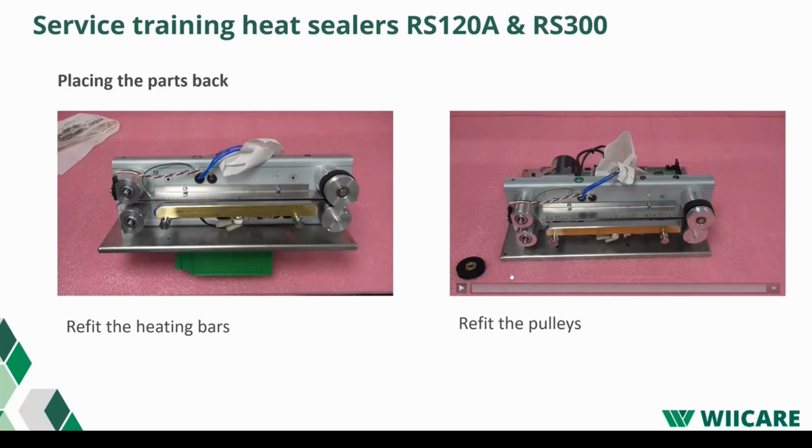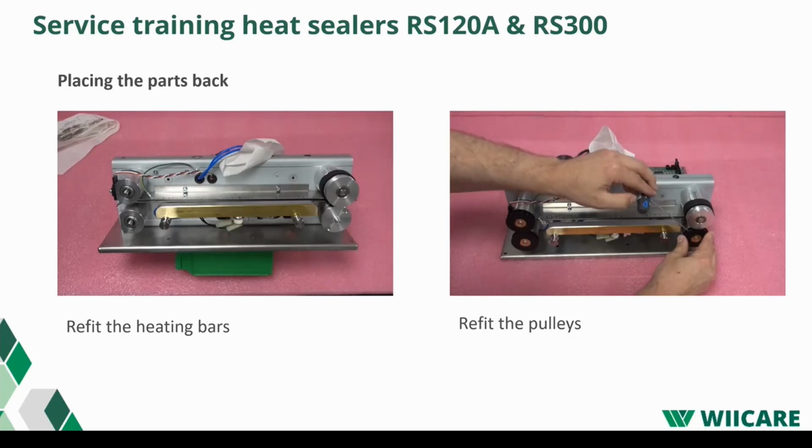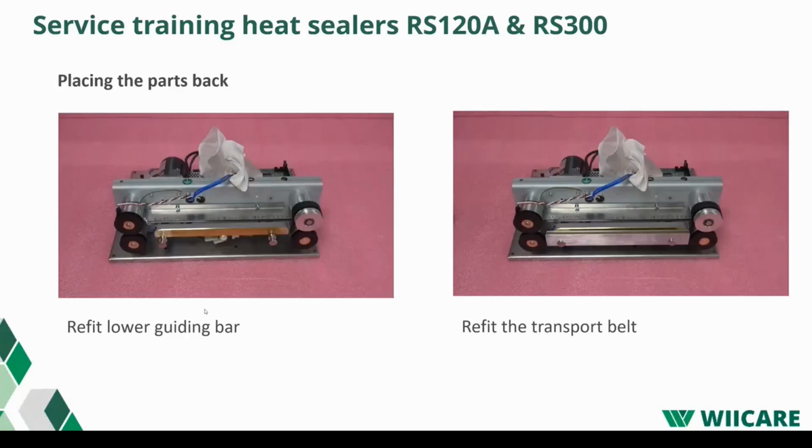All right, in this video you will see how to refit the pulleys. Now we can put the pulleys back on. If the pulleys are worn or damaged, replace them with new ones. In this video, it's being shown how to refit the lower guiding bar.